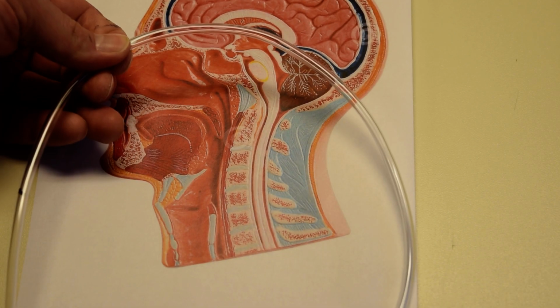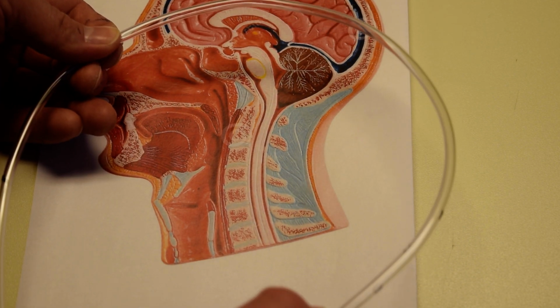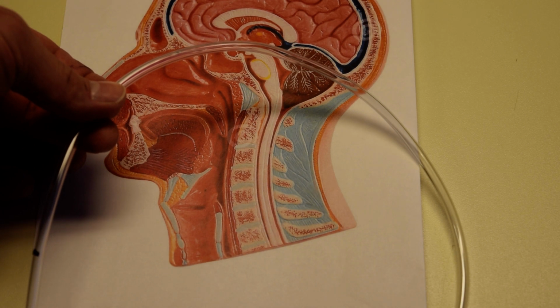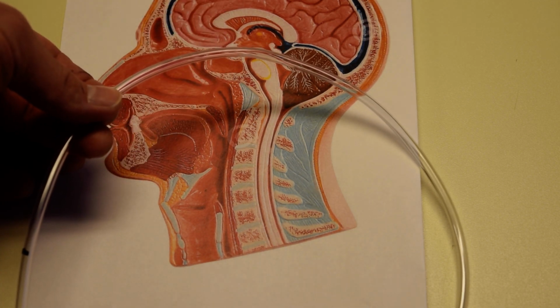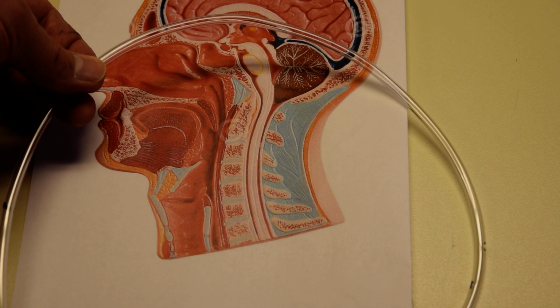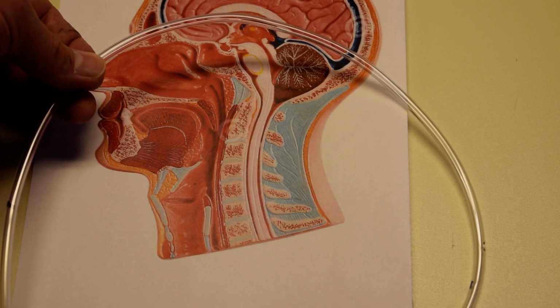Another pro tip here: once I've measured my NG tube, before I do my insertion, I will apply my securement device to the tube at the point that I want it to be, facing towards the patient prior to the insertion. That way, once I get to that point, it's one less step of manipulation that I have to do while the patient is trying to tolerate the procedure.